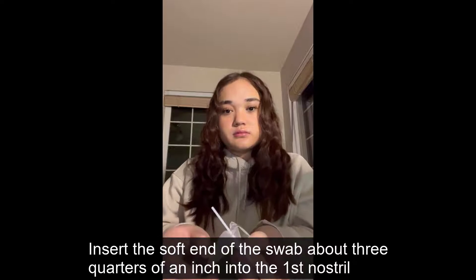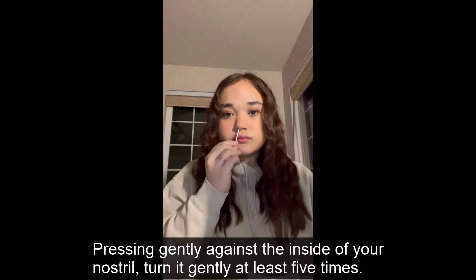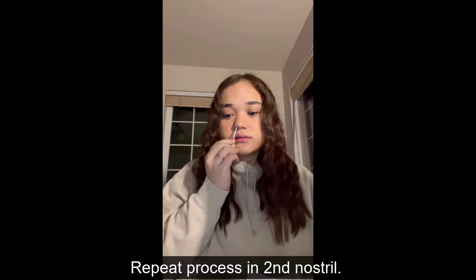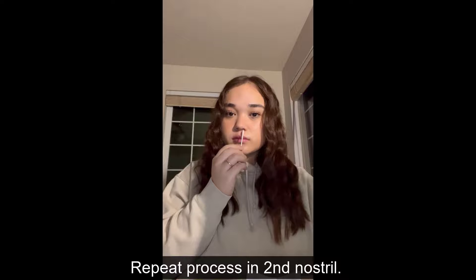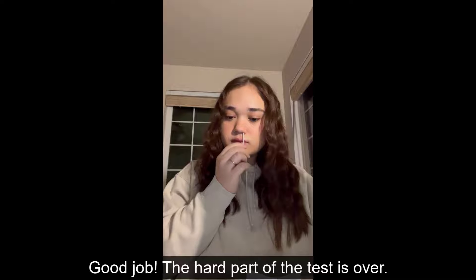Step 3: Swabbing. Insert the soft end of the swab about 3 quarters of an inch into the first nostril. Pressing gently against the inside of your nostril, turn it gently at least 5 times. Total time swabbing of the nostril should take approximately 15 seconds. Repeat the process in the second nostril. Try to get the swab as wet as possible while rotating it in your nose. The hardest part of the test is over.